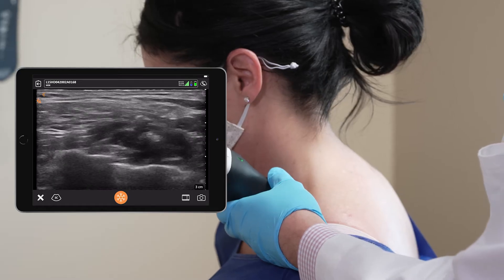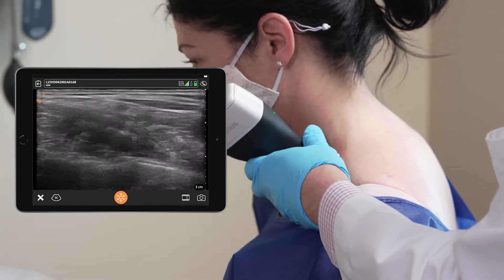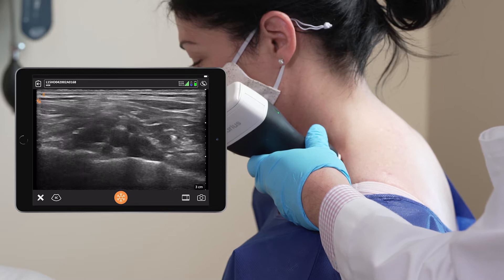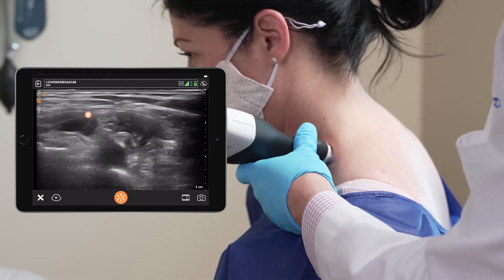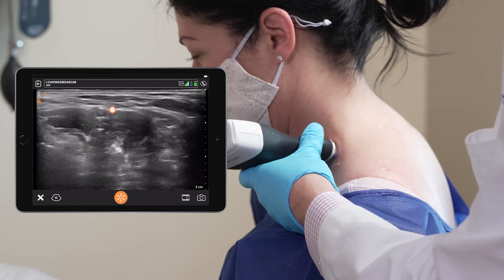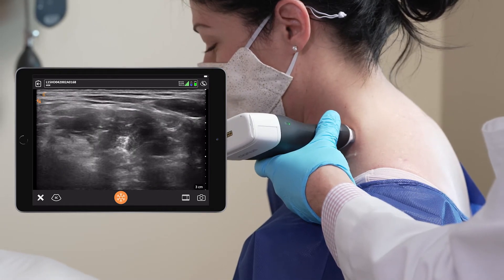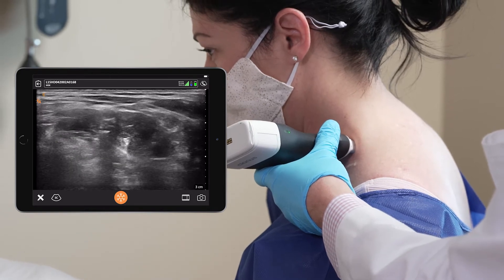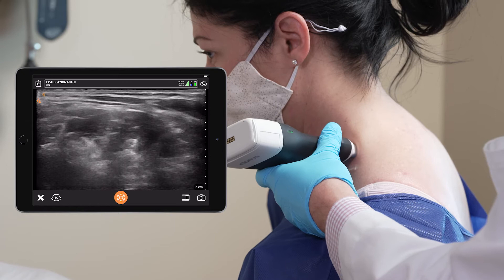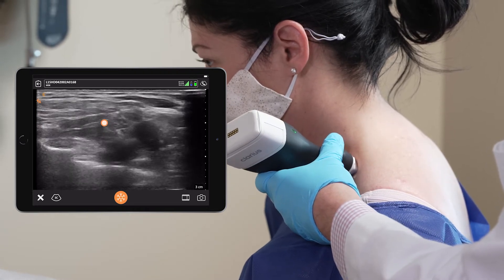I'm going to scan looking for the subclavian artery and the brachial plexus nerves in the supraclavicular fossa. Scanning backwards, I'll find the interscalene brachial plexus lining up right here. Her radiculopathy is actually lower down at C8, so you're not going to see the C8 nerve as clearly — that's why I'm going more distal, back to the supraclavicular brachial plexus.